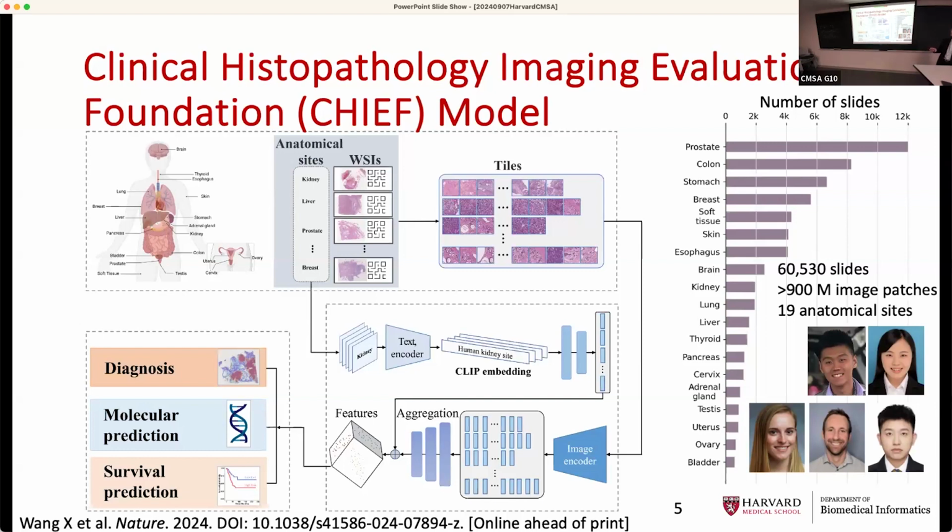And we put the extracted text into a text encoder, and we use the CLIP-based embedding to extract the embeddings from there. The CLIP model is a multi-modality model developed by OpenAI, and the goal is to align the text-based descriptions with the image-based features.